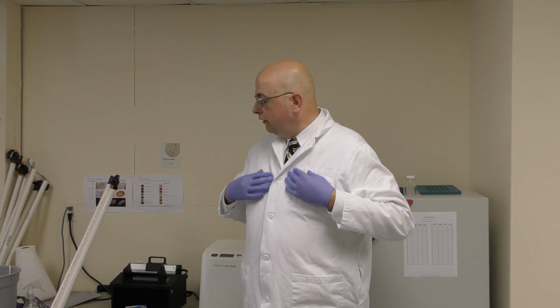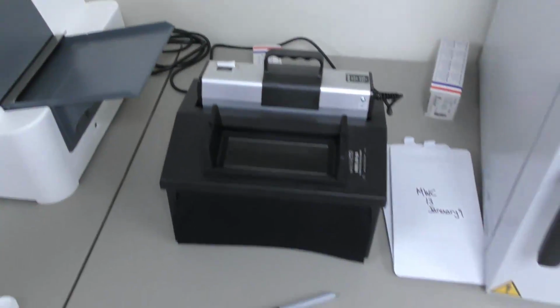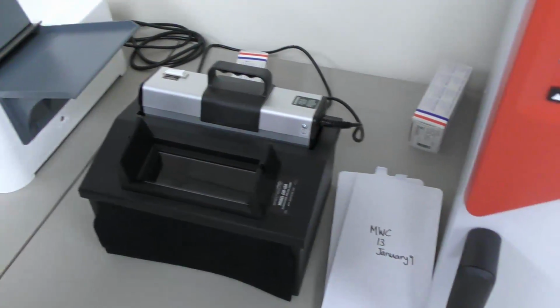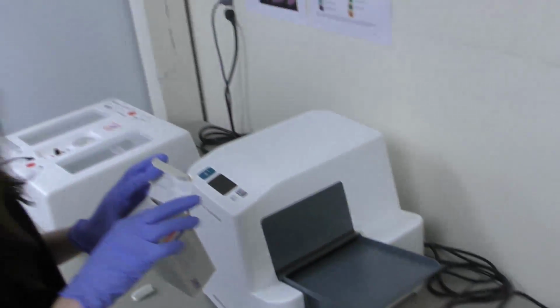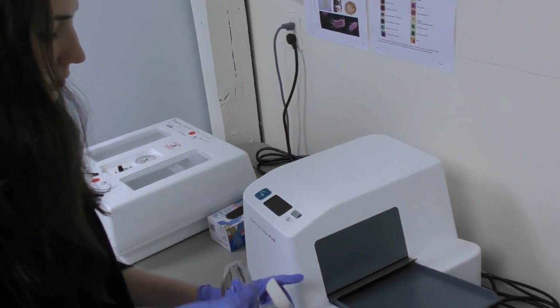In the lab, it's always good to have a lab coat on. The materials that the Colilert procedure has are not overly hazardous, but you could potentially spill stuff on you, and it's just nice that if it spills on your lab coat, you can remove your lab coat and wash it and not have to worry about it.